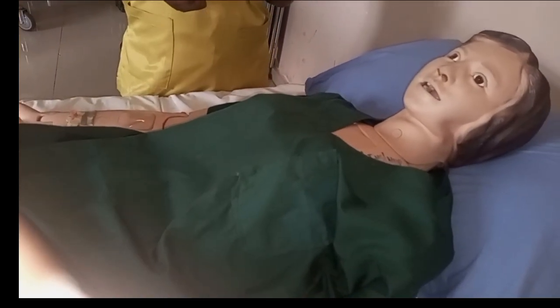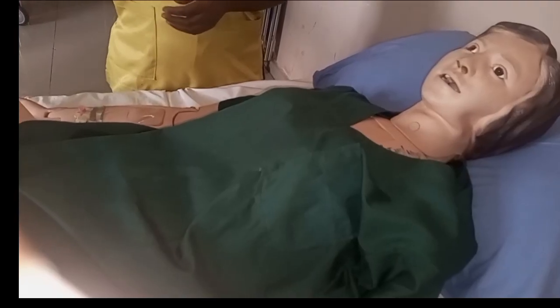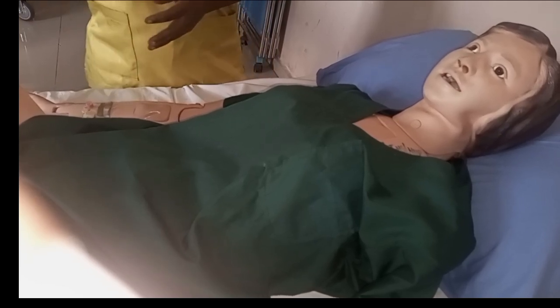For example: 'Good morning, Miss Helen. I'm Nurse Clement and I'm here to take care of you today. I'm going to pass a catheter — remember you were unable to pass urine — so I'm here to pass a catheter to you. Do you have any allergy to latex? Do you have any allergy to any antiseptic? Please let me know if you do or you don't.'